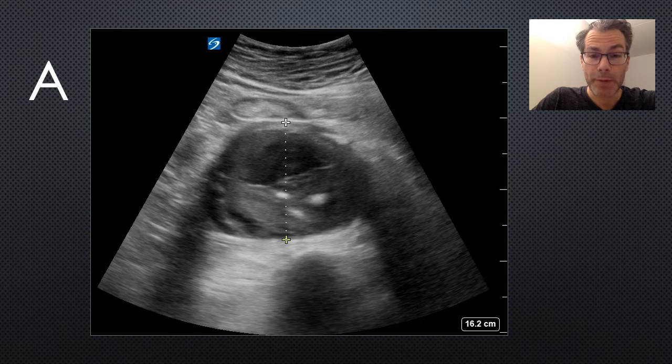So the fourth part of the HIMAP is A for aorta. So I'm sure you can appreciate this is a big, juicy AAA. So here's the vertebral body at the back. This is the aorta. And just a reminder to make sure you always include any intramural thrombus in your measurement. I'm sure you can appreciate if you only measured the lumen here, you'd massively underestimate its diameter.